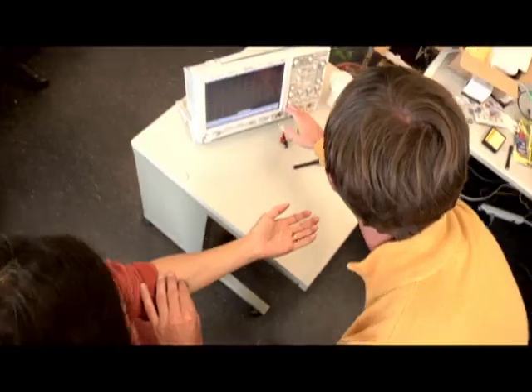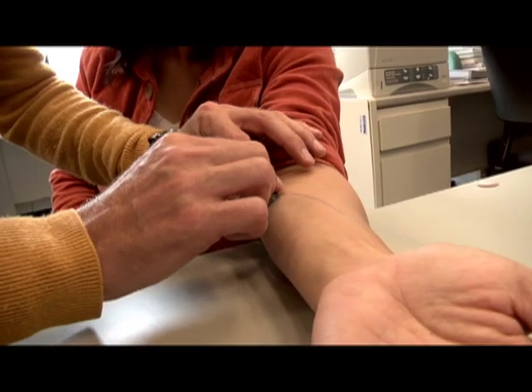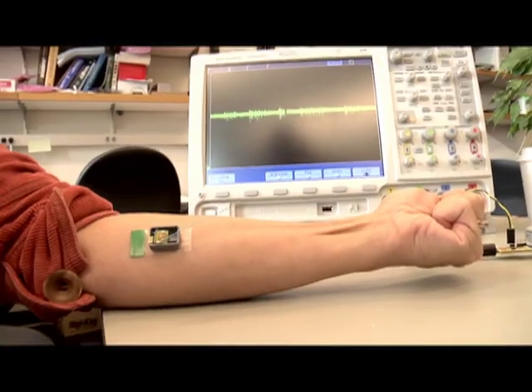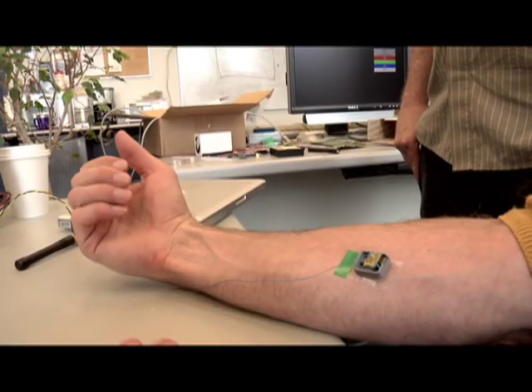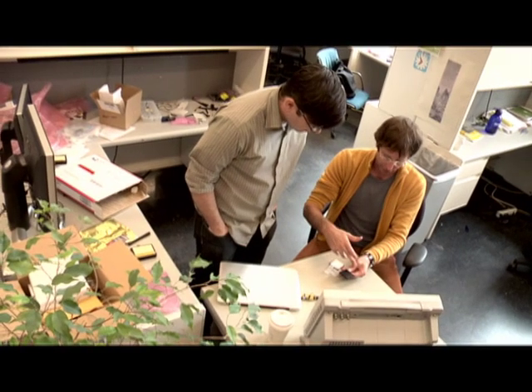With the help of Brian Otis and his wireless electrodes, we use signals recorded from muscles which may be impaired. The process itself is actually already helping some people to move their hands better. We hope to understand the neural mechanisms behind that recovery as well as deliver an effective therapy. What we developed is really a research tool. Over the course of around three years, we've developed core technologies that make a really useful tool, and we've realized we can apply it to applications beyond simply research.